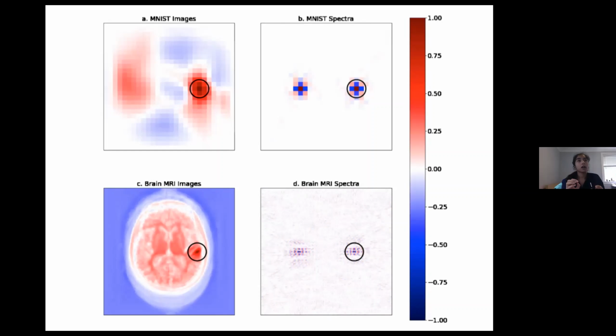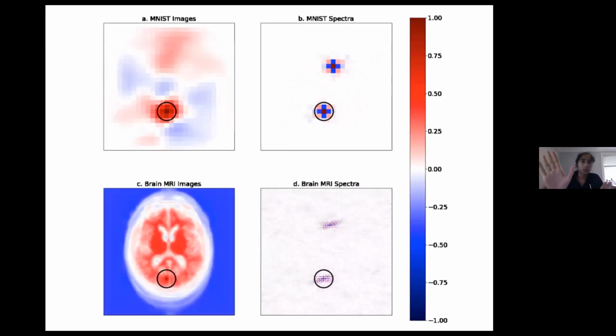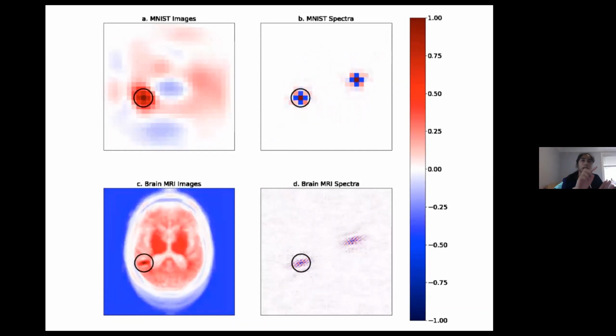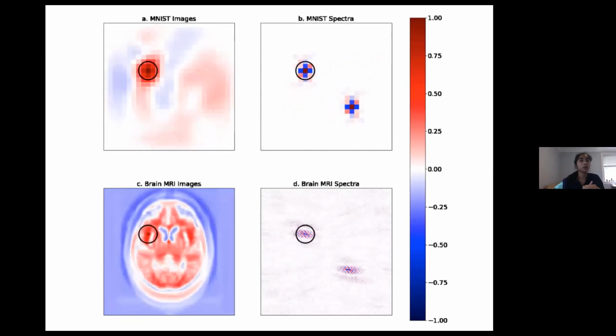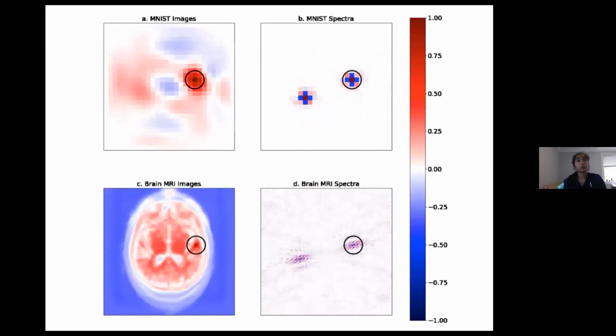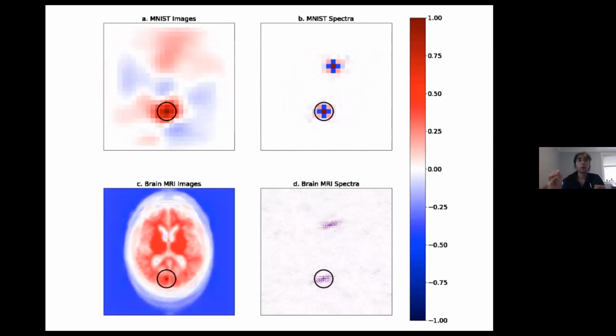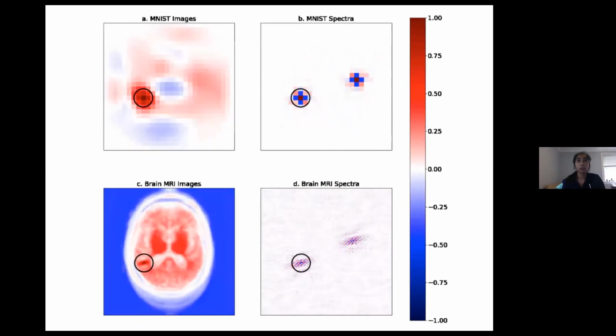And so the idea here is that just like we could use convolutions in order to do inference in the image space, we can apply really similar techniques in the frequency space and do a good job of inferring data there. And this slide just shows exactly the same visualization, but across a wider range of pixels and locations in both the frequency space data and the image space data. And you can see that the effects that I described in the previous two slides are pretty consistent across the image, and they're not specific to just one location or one point in the frequency space data.